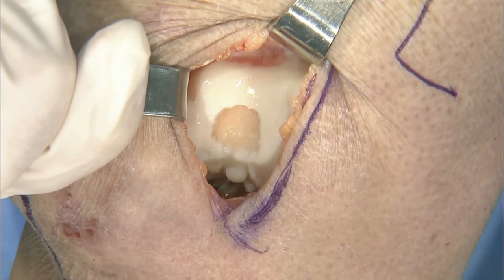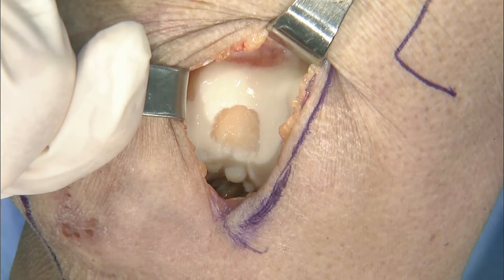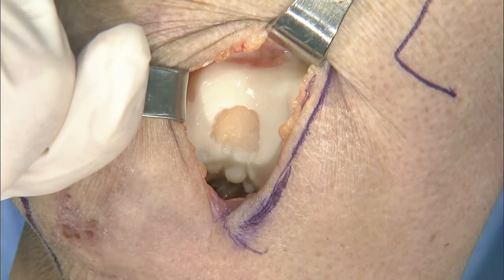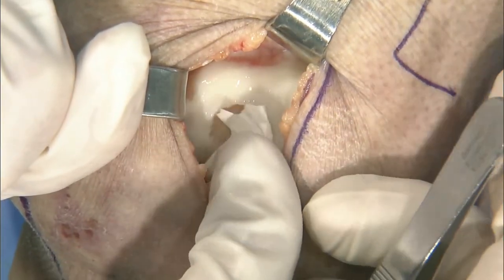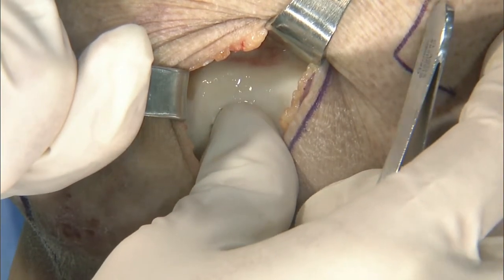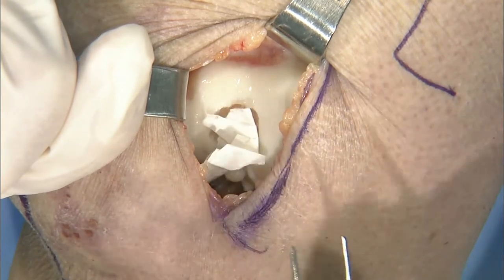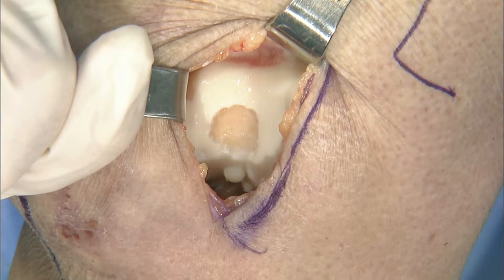The other thing I'll do, if we pretend I go back to the preparation, we don't have a lot of it here, is take my PA or any assistant and take some thrombin-soaked Gelfoam and put it into the defect right there, and have my assistant hold that in place with some finger pressure in order to really stop the bleeding. I would tell you that that really does it. There isn't too much more that you have to do. It's usually pretty clean at that point, as long as you haven't created a big cavitary defect.